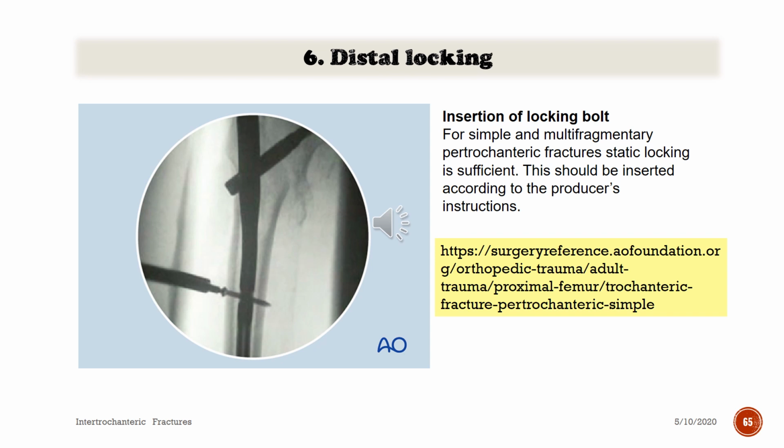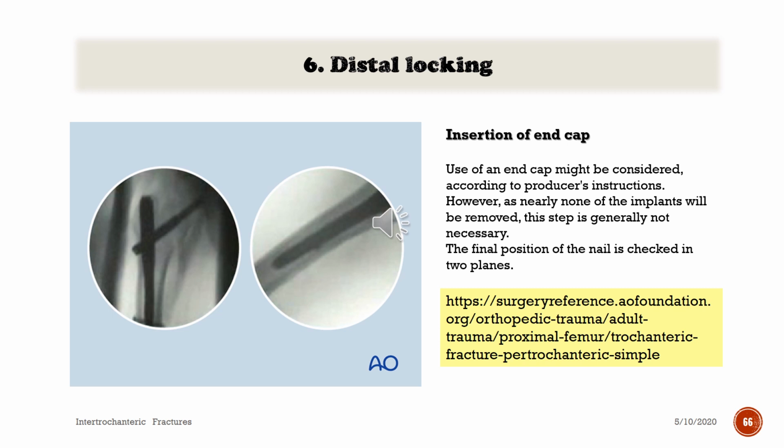Insertion of the end cap. Use of an end cap might be considered according to the producer's instructions. However, as nearly none of the implants will be removed, this step is generally not necessary. The final position of the nail is checked in two planes.